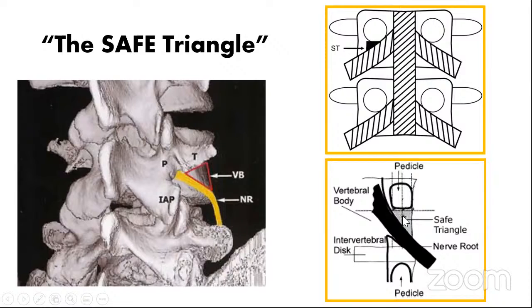And sometimes the needle might hit the nerve root sleeve, and then the spread could be very nicely seen across the sleeve. But if you go still more on the inside of the sleeve, then you might damage the nerve by causing an intraneural injection as well.